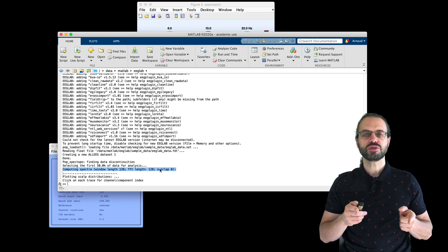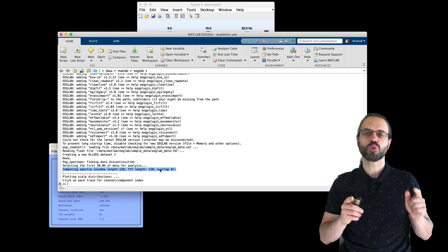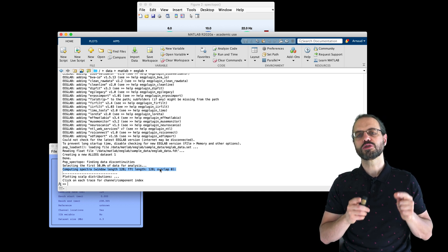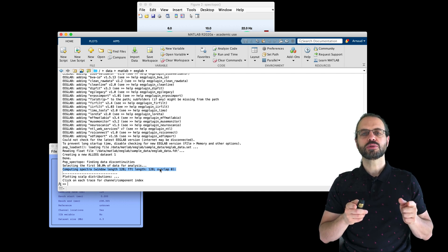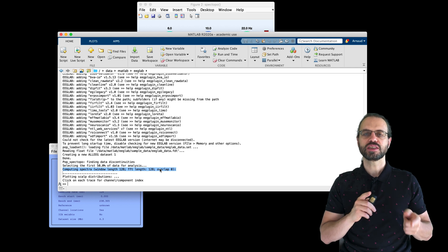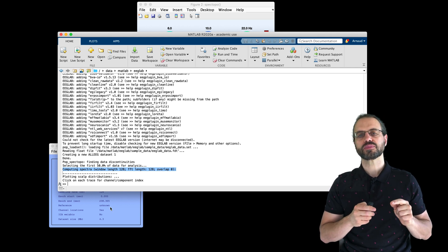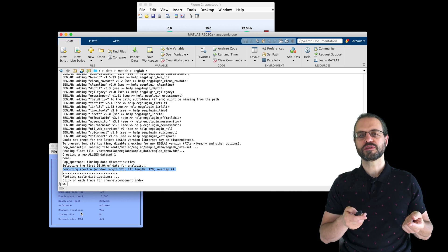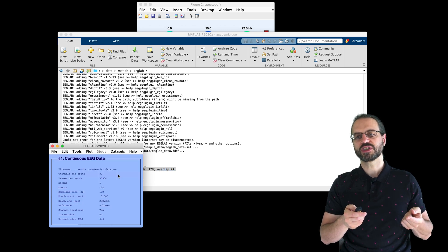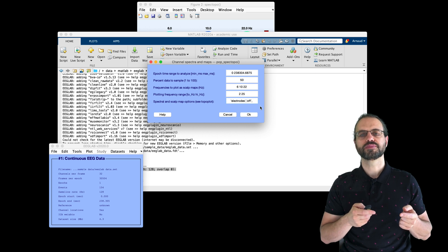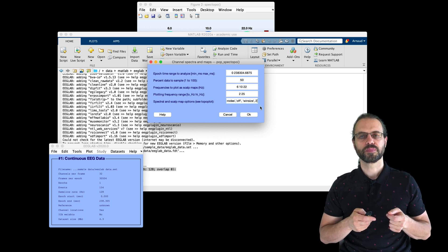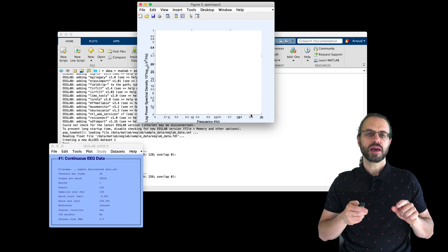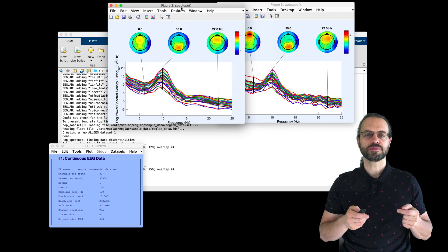And here you see the window size is 128 samples, so 1 second, which gives me a resolution of 1 Hz. I can also increase the frequency resolution by either zero padding or increasing the size of the window. Here I'll use a window of size 256 Hz so I get a resolution of 0.5 Hz. And you can see how smoother it is now.